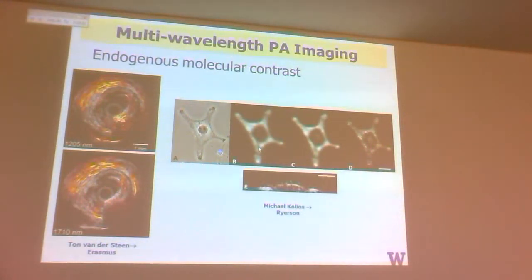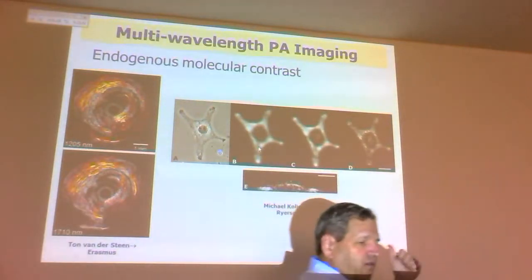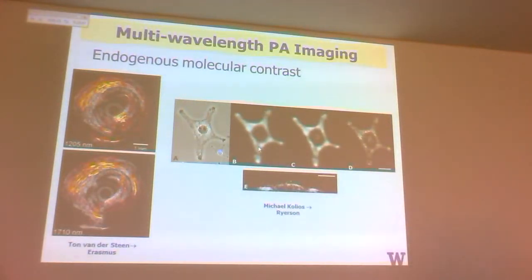And I think it has to do with the world that they were in. If you're in real-time clinical ultrasound, or real-time clinical imaging, you'd be making ultrasound pictures, if nothing else, just to guide you anatomically to where you want to look. Okay, this last one is just a precursor. This is not done with the kind of photoacoustic microscope we're going to talk about at the end, but it's just leading towards that.